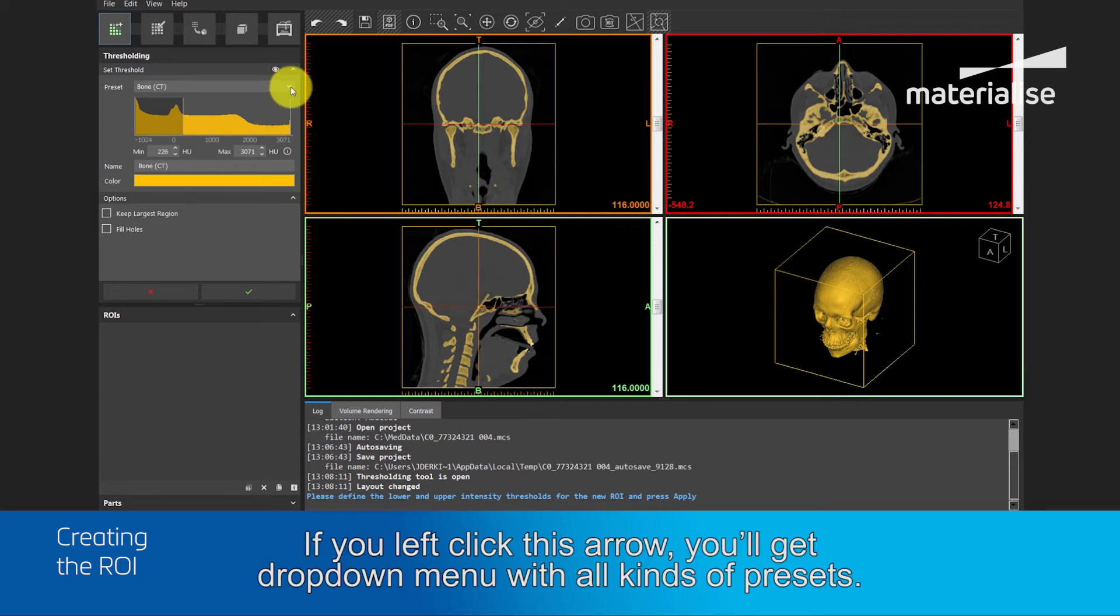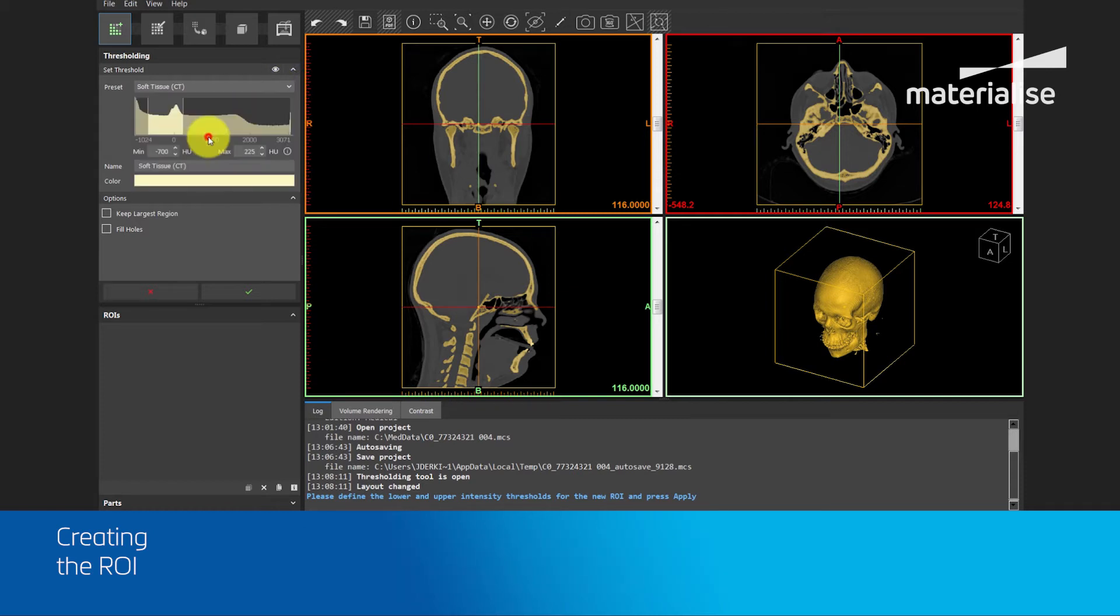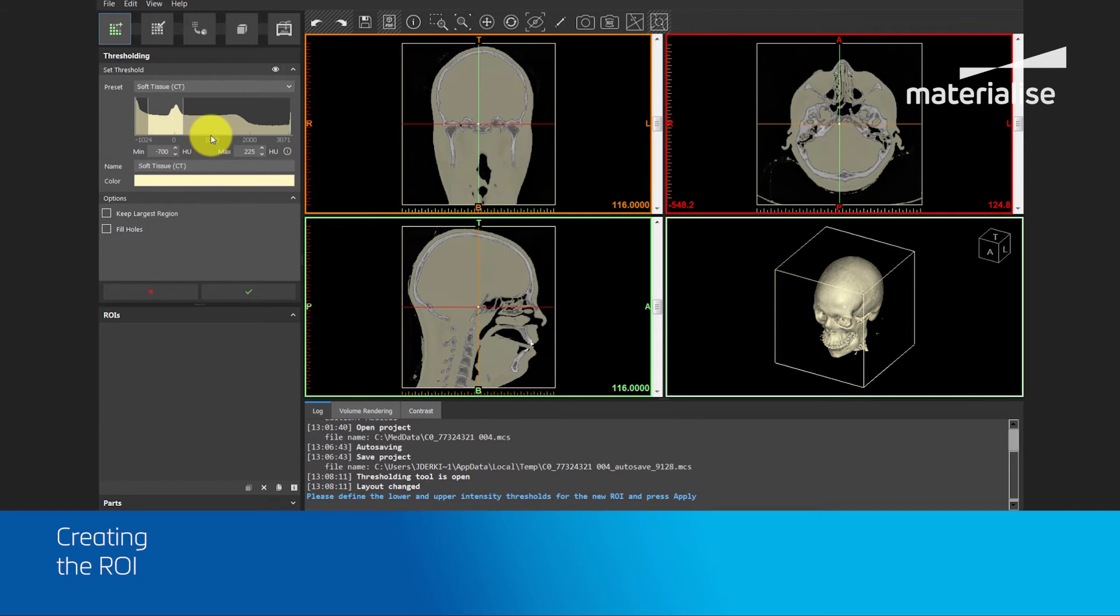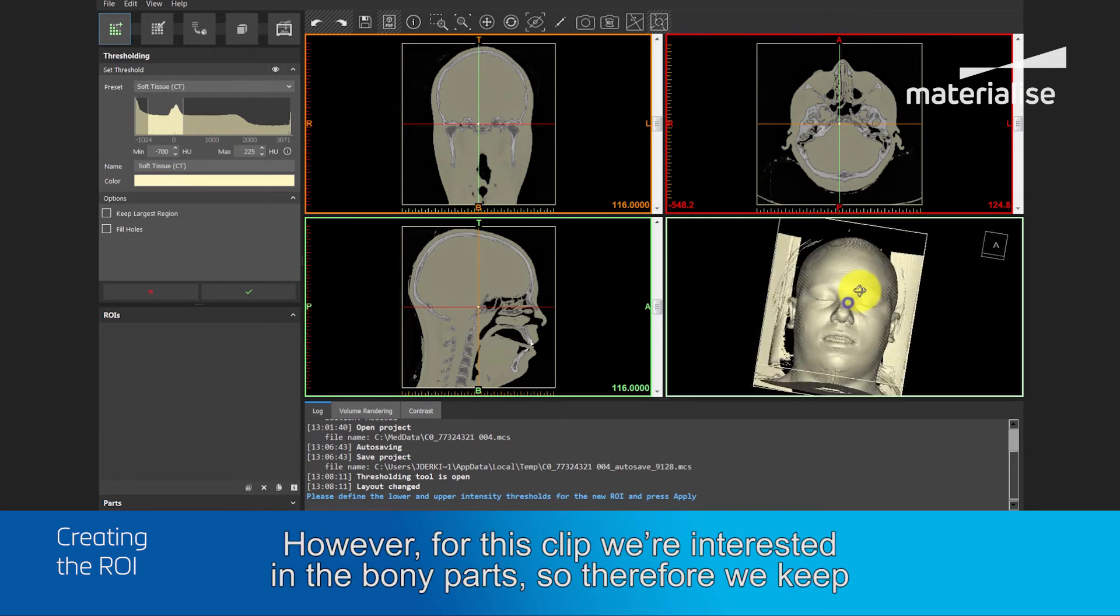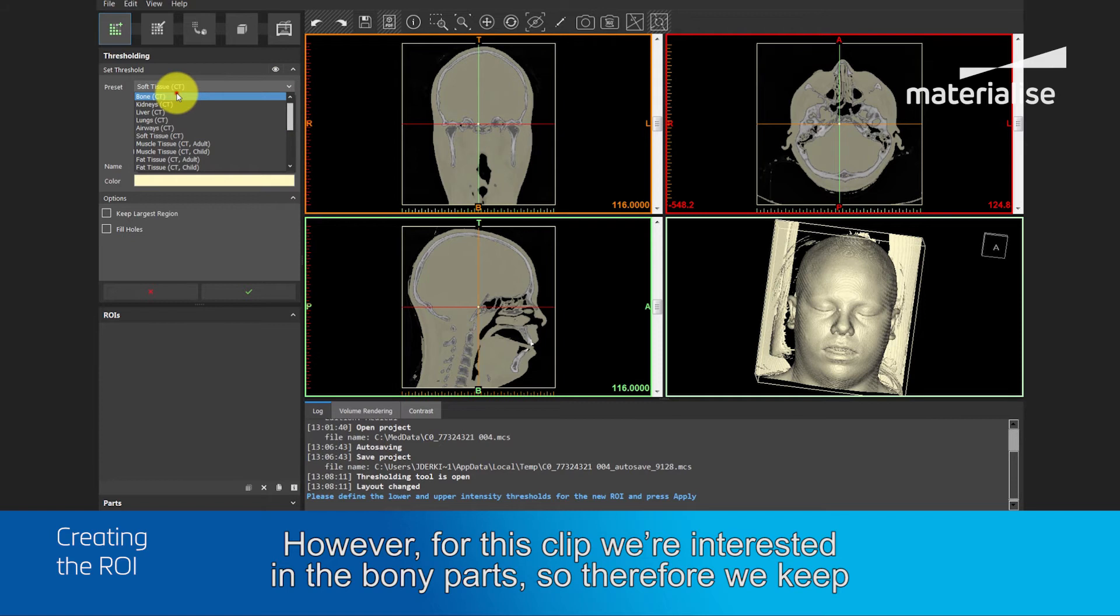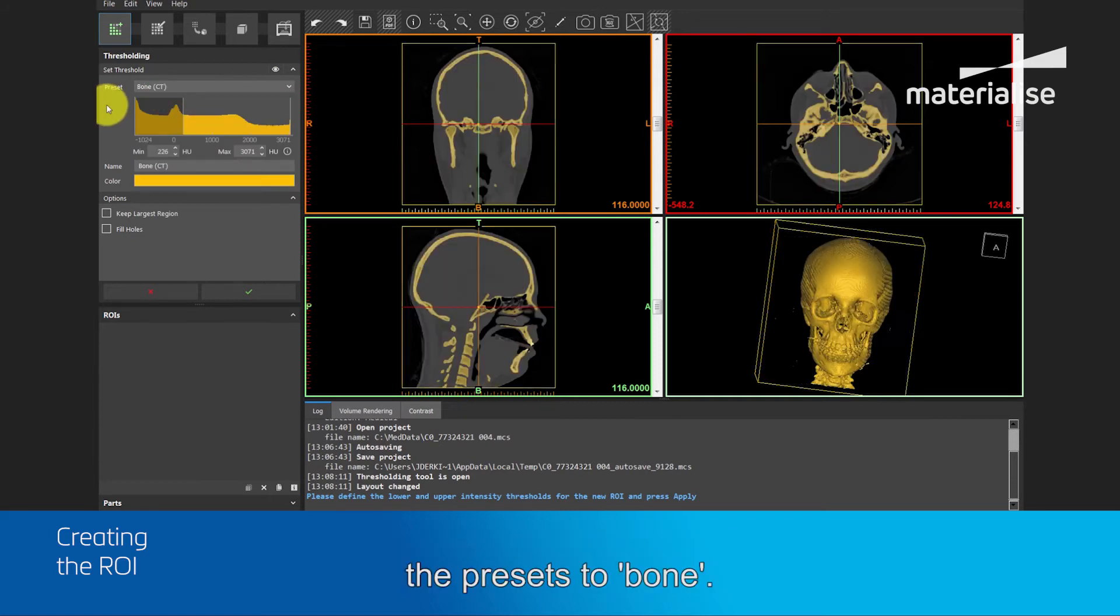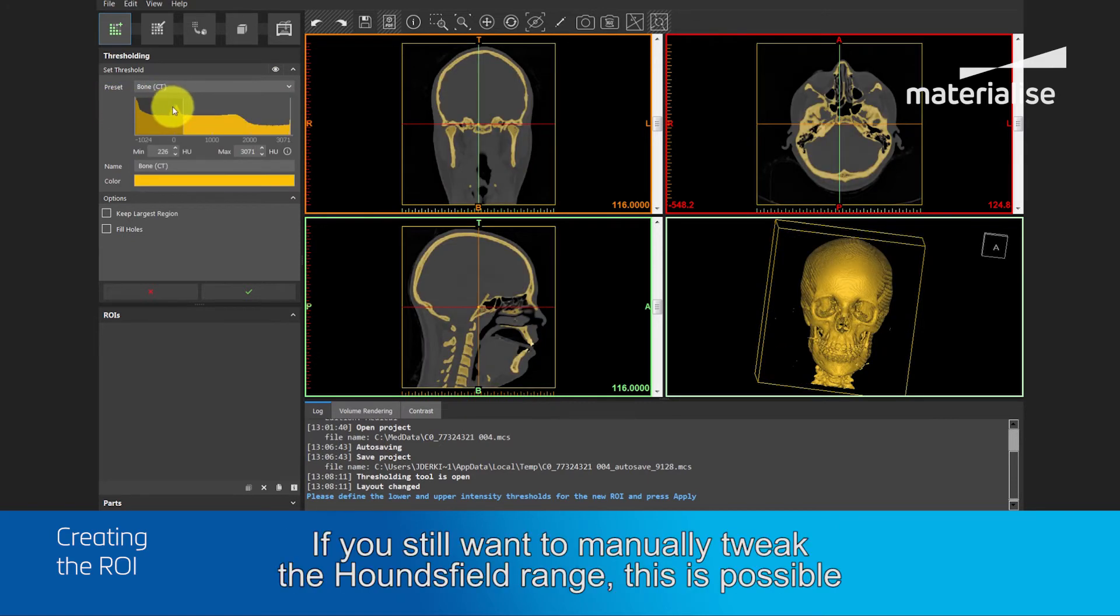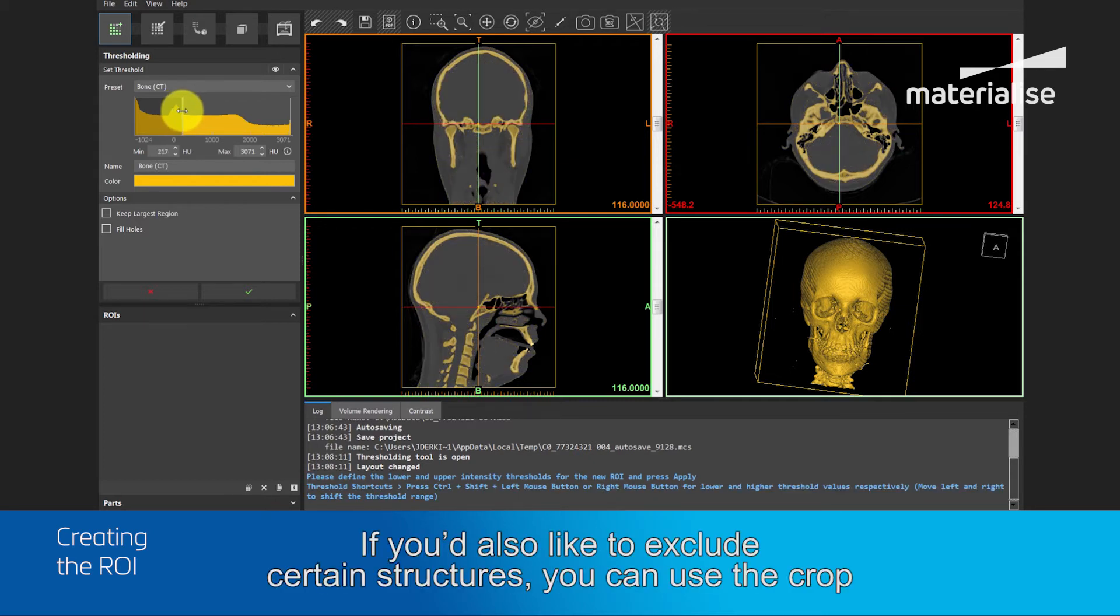What you also see is that a preset has been set on Bone CT. If you left click this arrow, you will get a drop down menu with all kinds of different presets. However, for this clip, we are interested in the bony parts, so therefore we keep the presets to Bone. If you still want to tweak manually the Hounsfield range, this is possible by moving the sliders.